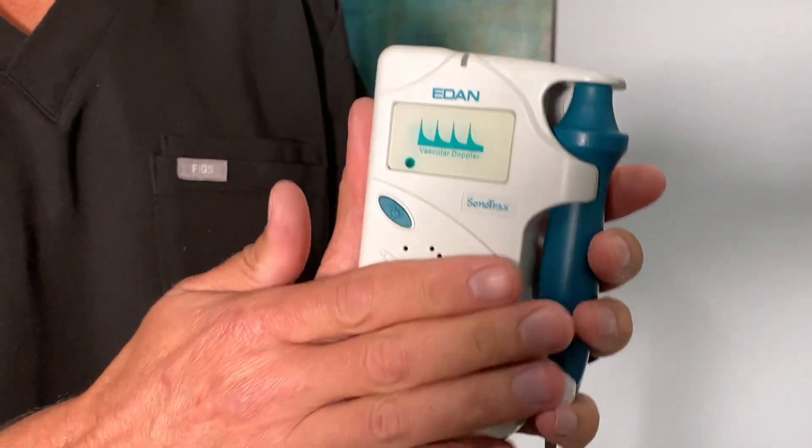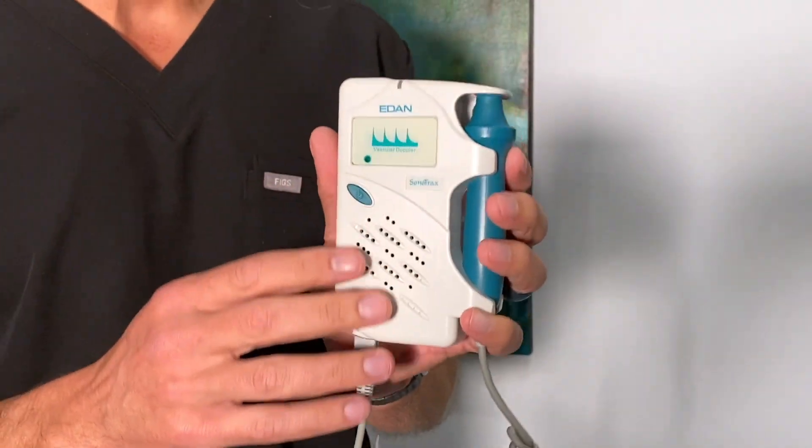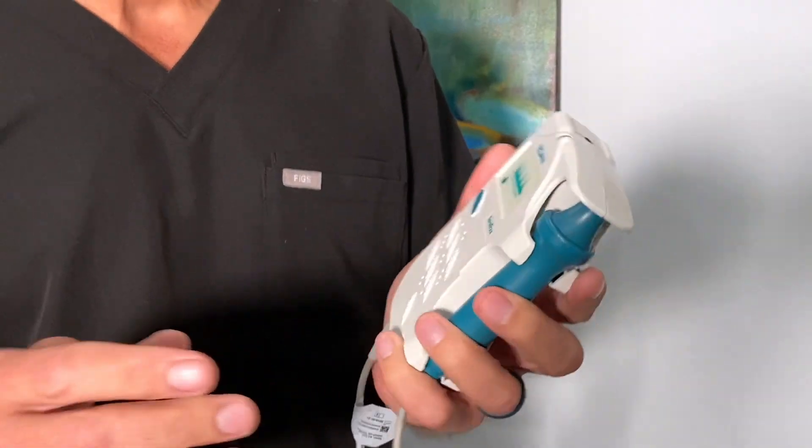It goes back to our days when we were residents and interns, and we were checking the pulses on our peripheral vascular patients, or on the flap patients. And it uses a vascular Doppler. This piece of equipment is $120, and it uses the same technology that ultrasound does to check the pulses of vascular structures. What I'm going to show you is how I used it on my daughter to check some of the major vessels of the face.